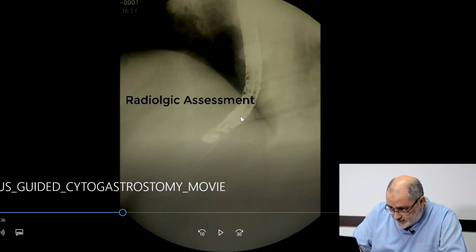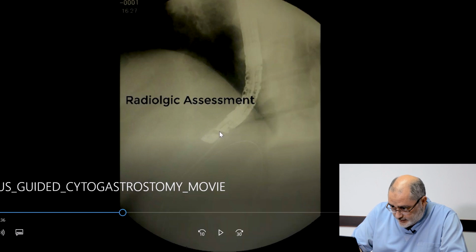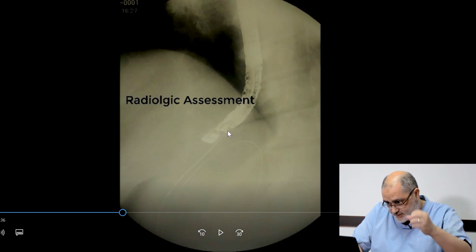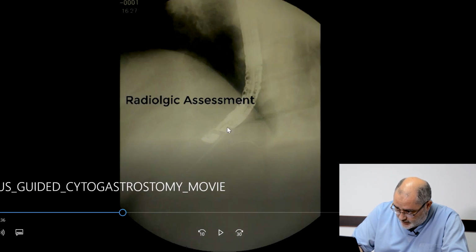Because if it is kinked, when I introduce the cystotome or the balloon, it can push the wire in this direction and may dissect inside the wall, and this will lead to complication, especially if the stent is positioned in this false track of the wire. So the wire should be straight in this area. Okay.